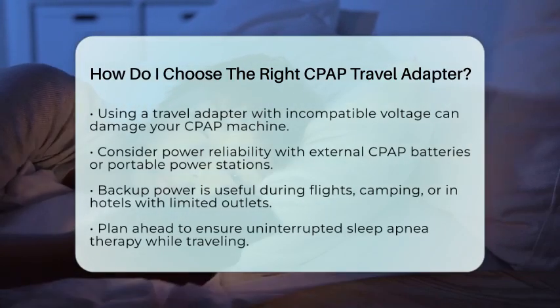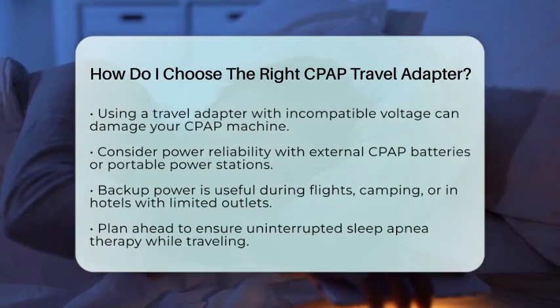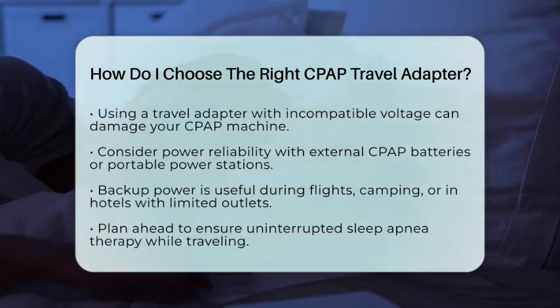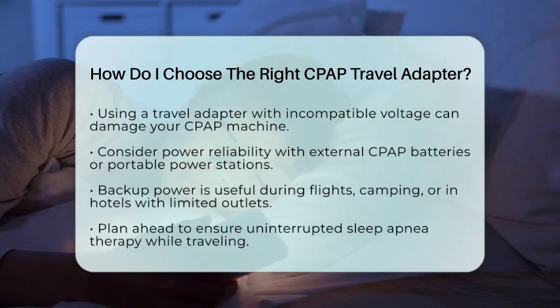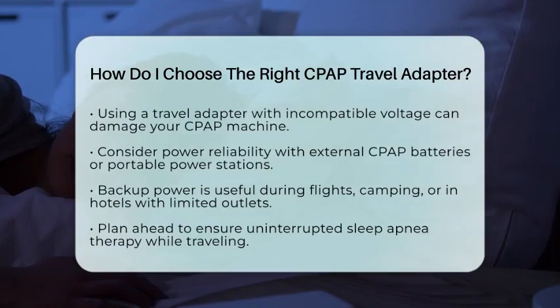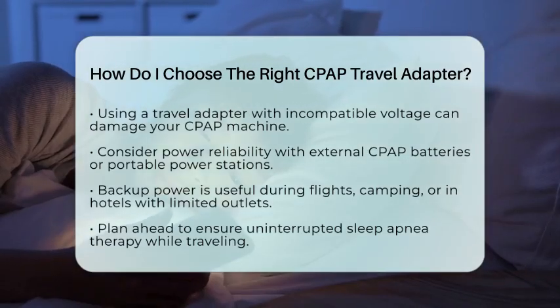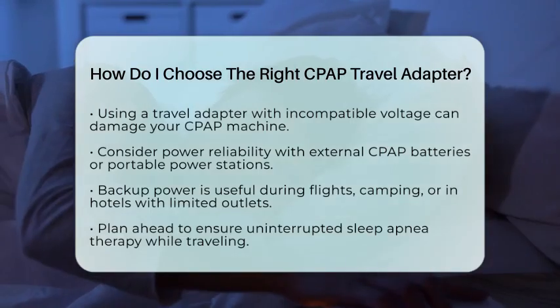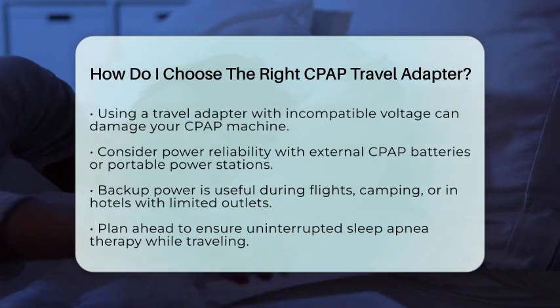To summarize, when choosing the right CPAP travel adapter, verify your CPAP machine's voltage compatibility, determine the plug type of your travel destination, and select a universal travel adapter that supports those plug types. If necessary, consider a voltage converter only if your machine is not dual voltage and its power requirements are within the limits of the converter. Lastly, plan for backup power options like external batteries to ensure uninterrupted therapy. This way, you can maintain effective sleep apnea therapy while traveling without risking damage to your CPAP machine or interruptions in your treatment.